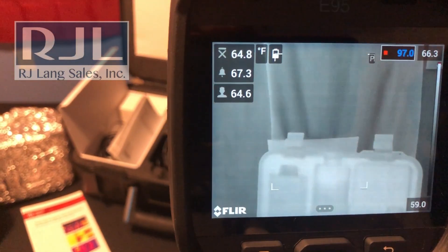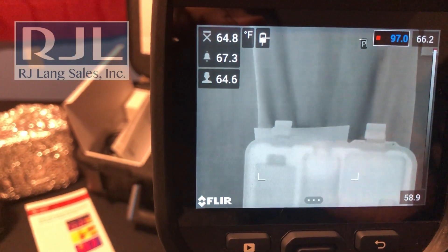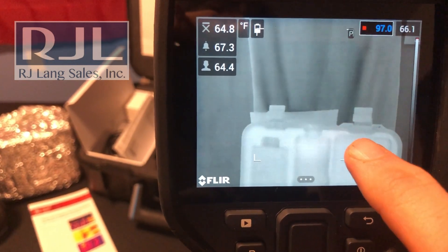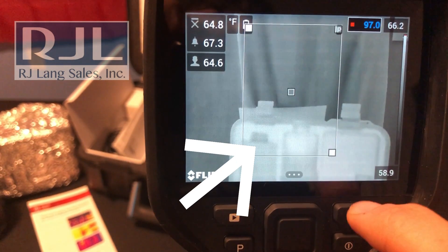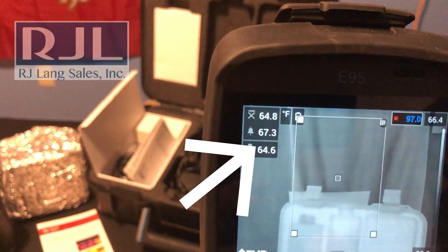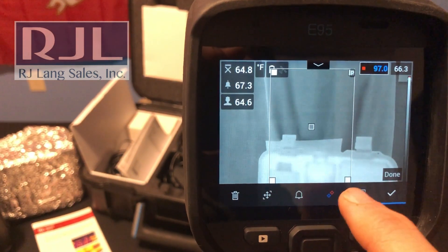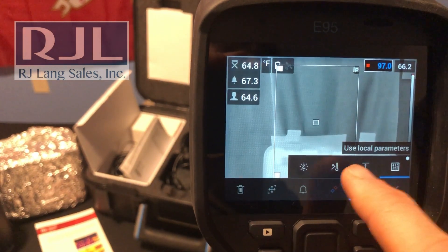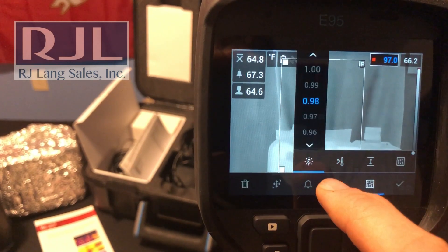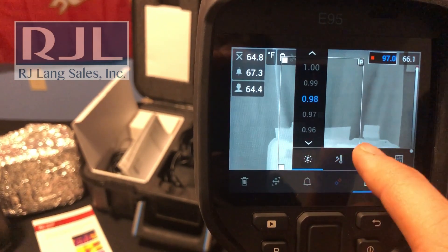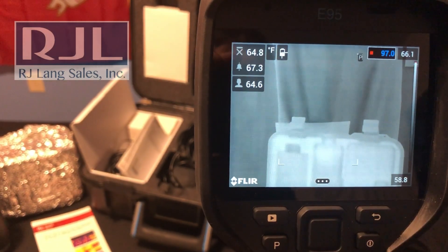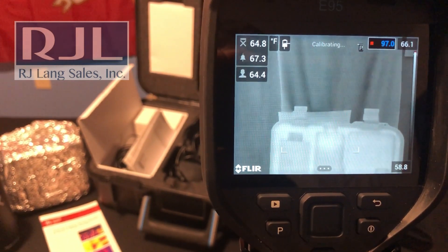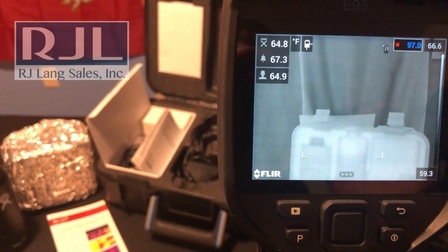Something else to consider is the emissivity rating inside of this box. Touch into the box, go into your settings, go into the parameters, and make sure that your emissivity is set to what you want it to be for your screening application.